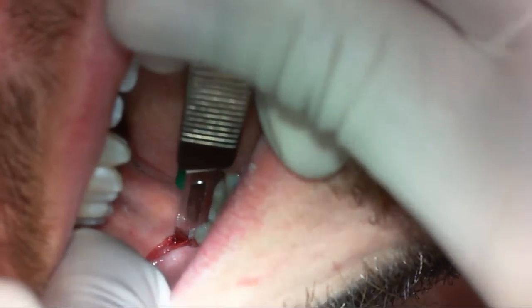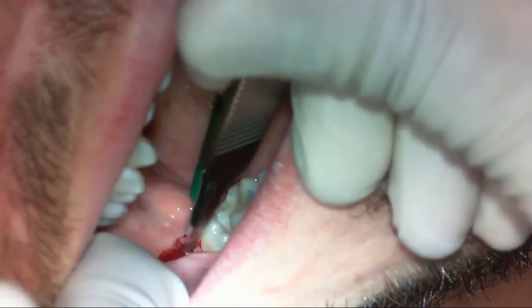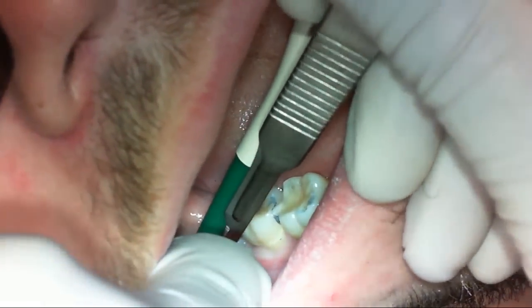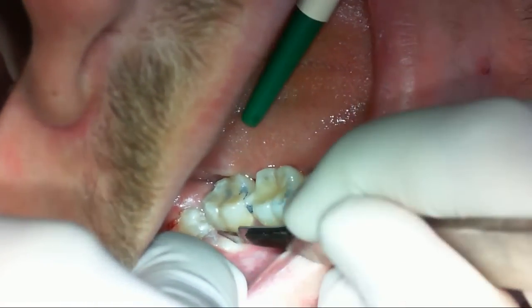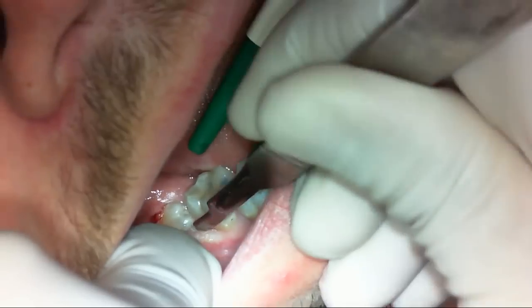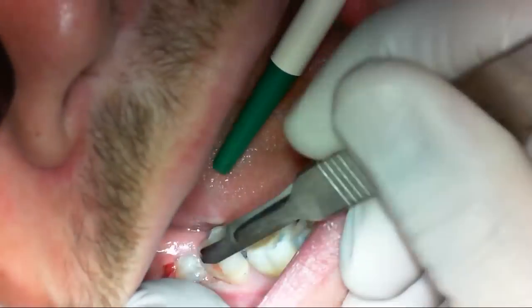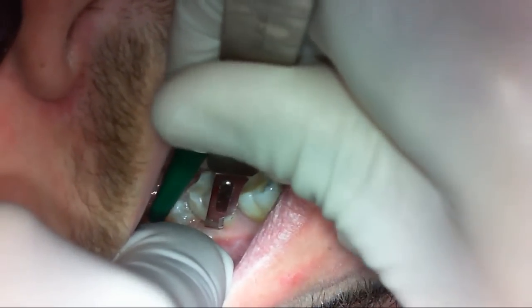That's why we keep the initial incision on the center of the ridge. You can run the blade from the tooth into your finger or from the finger to the tooth — whichever is easier. I find it easier to stretch the mucosa and run the blade from the tooth to my finger. I usually extend the mesial incision to the distal of the six without reflecting onto it, just so I can extend it further if needed.